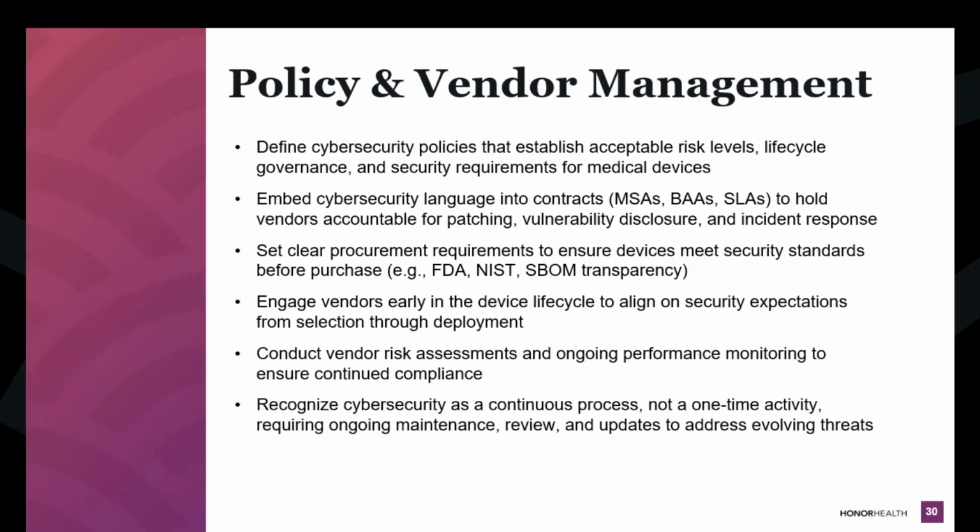You do patches, right? And my favorite example, I won't use the vendor's name, but infusion pumps, right? So if you go 2.5 years and can't remediate a vulnerability, we might not want to do business with you in the future, right? You're struggling in your research and development. So really, have them put in writing what they say they're going to do. So no over promises unless you're going to put it in writing is basically the gist of that.